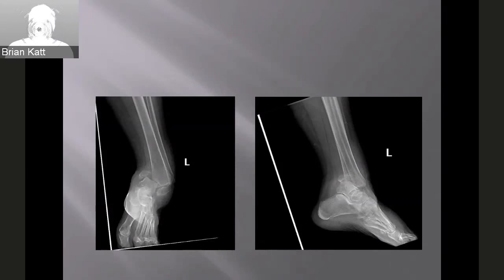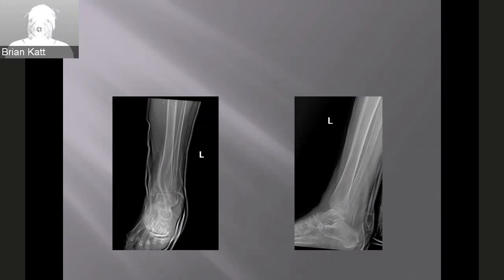So I still don't know how this one wasn't open. I think this is a 90-year-old that came in here. So you can see the urgency with reducing this right away. I can't take credit for the reduction with this, or maybe I should. You guys would know anyway.